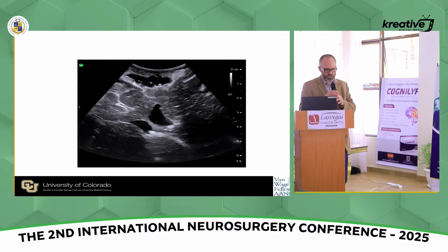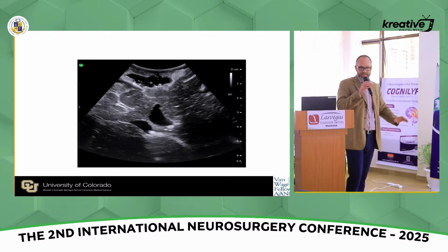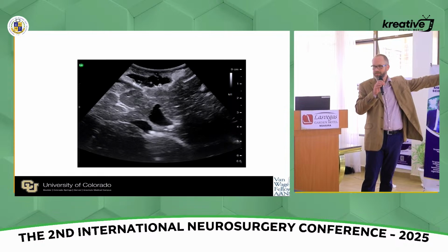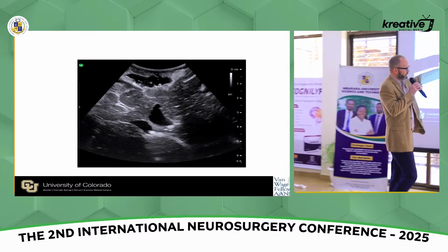This is just to show how bad some artifact can be. This is a piece of Gelfoam stuck in the cavity, and you can see nothing behind the Gelfoam.